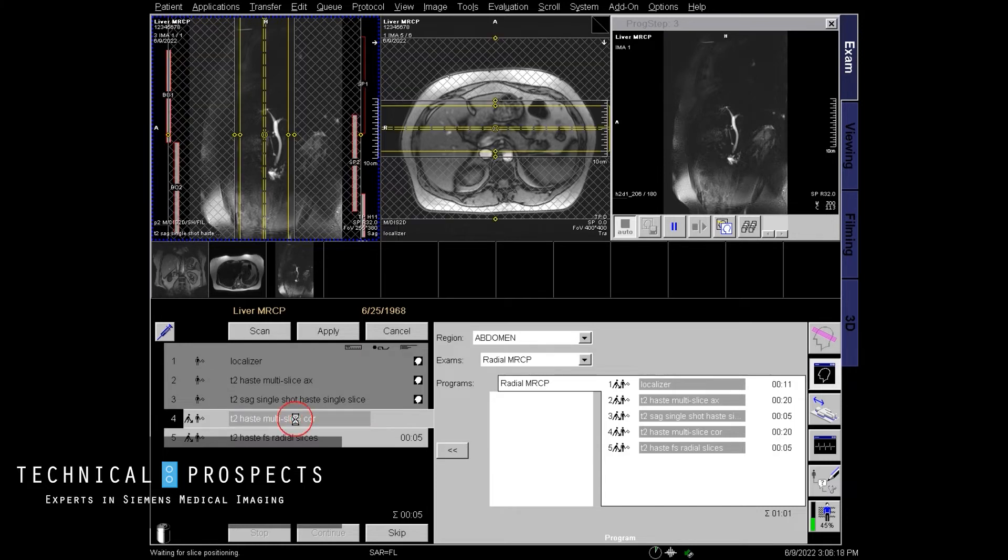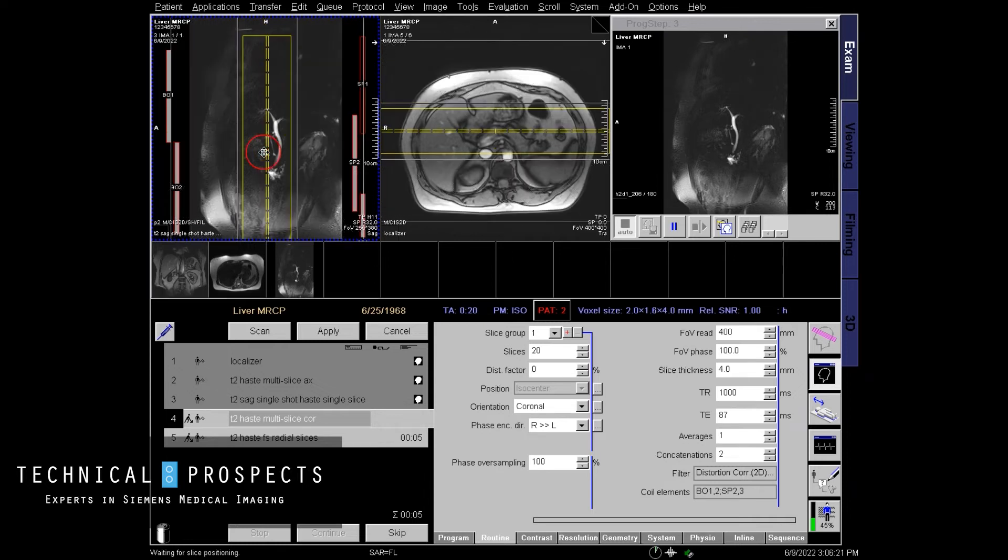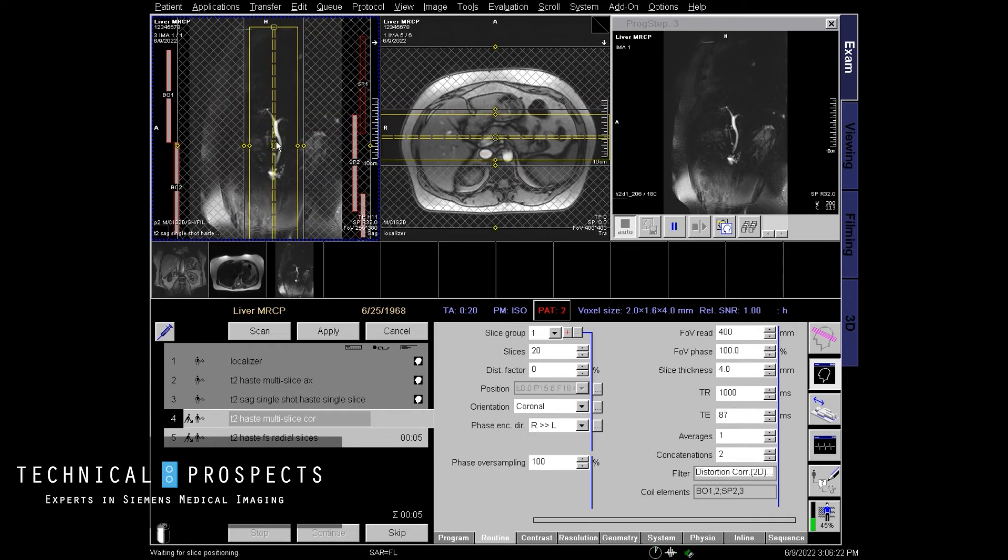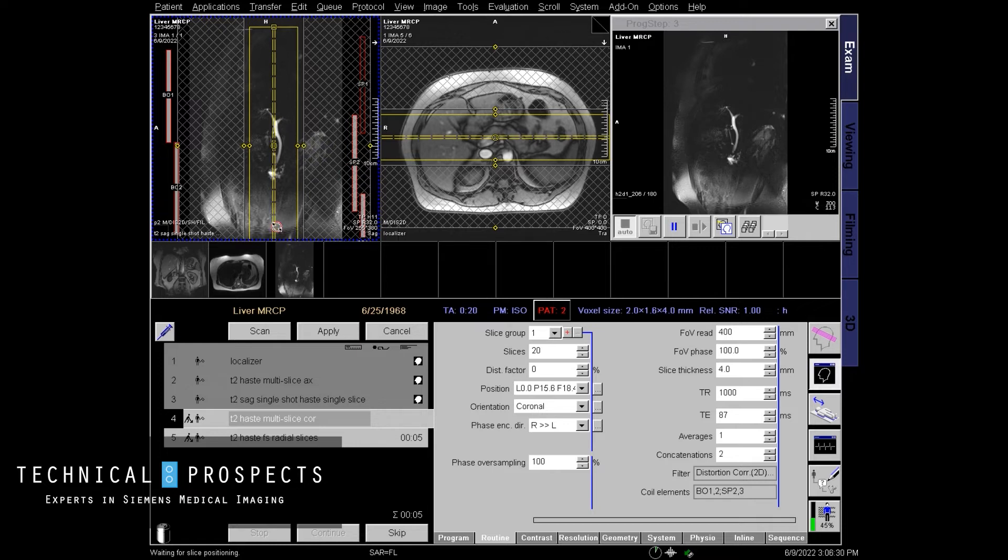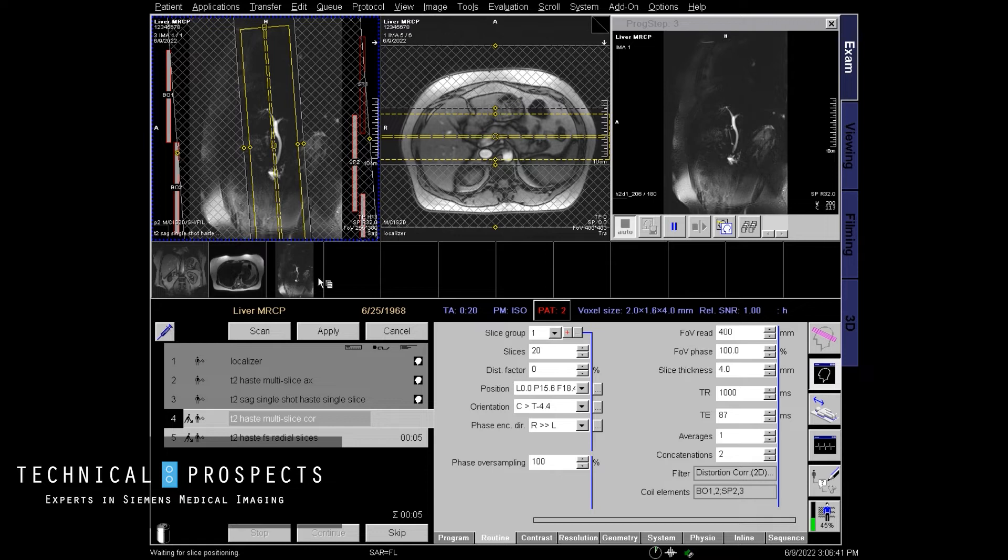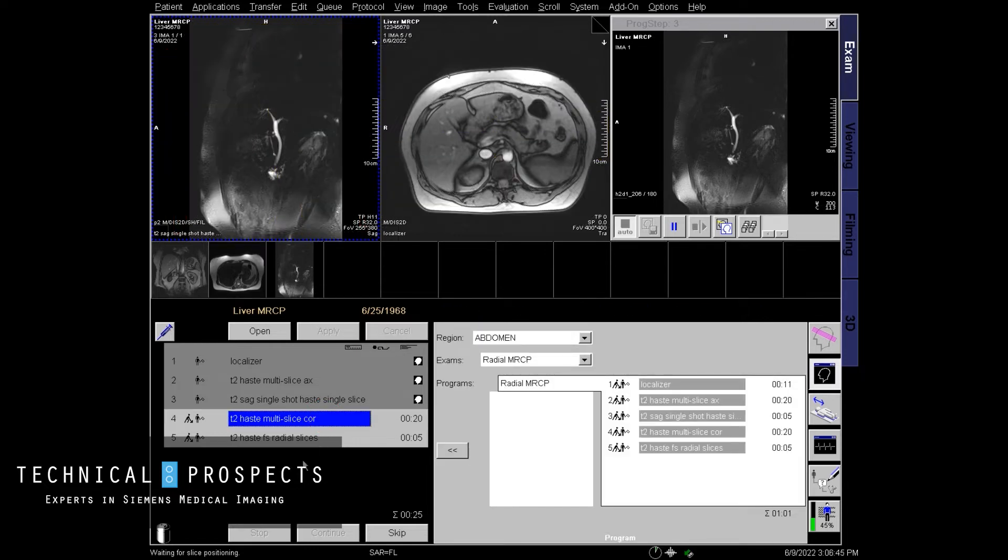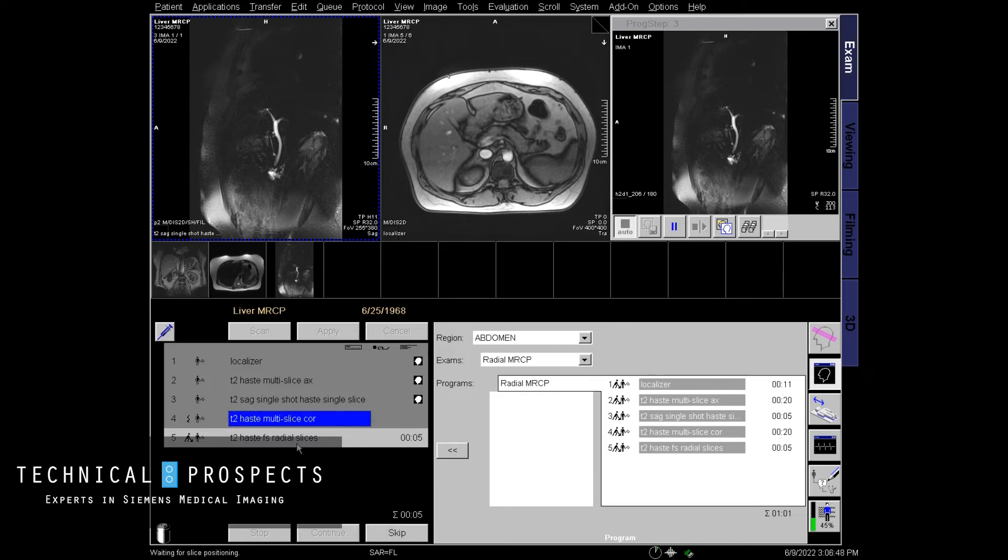Now, I'm not going to run this particular next sequence, but most people will have an angled biliary tree and it'll typically angle forward. And then if you angle your coronal forward along with the biliary tree, you will get a very nice looking coronal biliary tree. And you'll typically get one good slice right through the whole thing. Now, I'm not going to run this particular sequence for this tech tip. I'm going to go ahead straight to the radial slices.